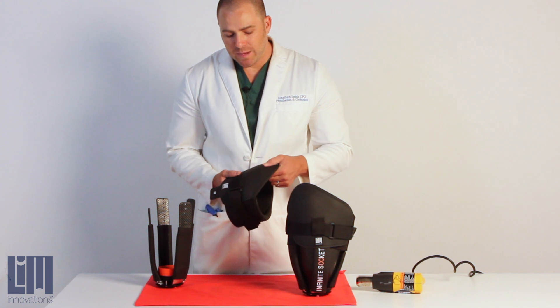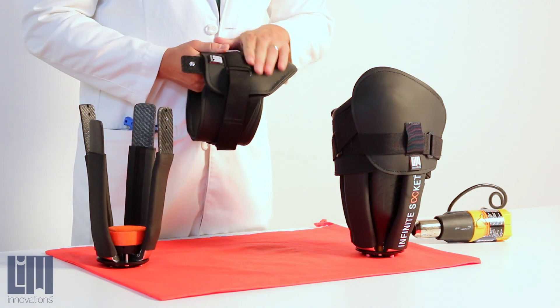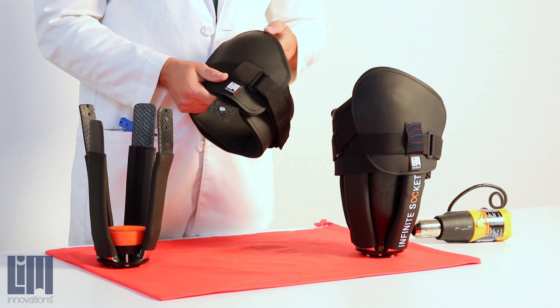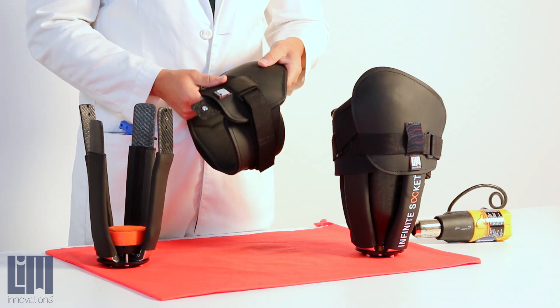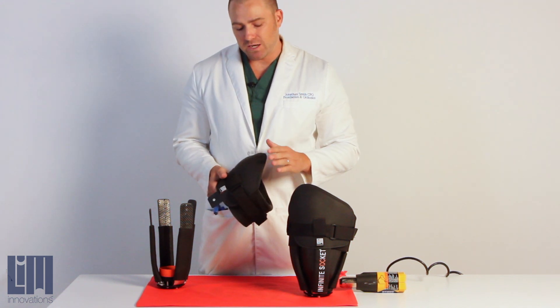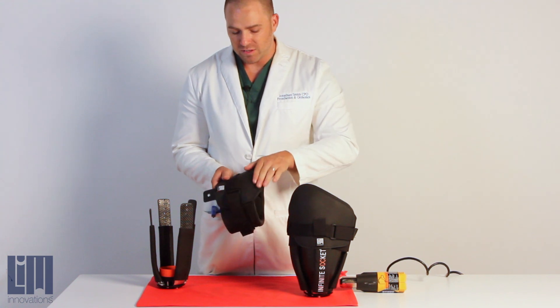Making changes to the shape of your brim is designed to be really easy with the infinite socket. The black material is antimicrobial, antifungal, and has a higher temperature resistance than the polyethylene encased within the brim itself. You want to use your heat gun on a low setting, and if it doesn't have a variable setting, keep the distance from the heat gun quite far so that you don't burn the surface.